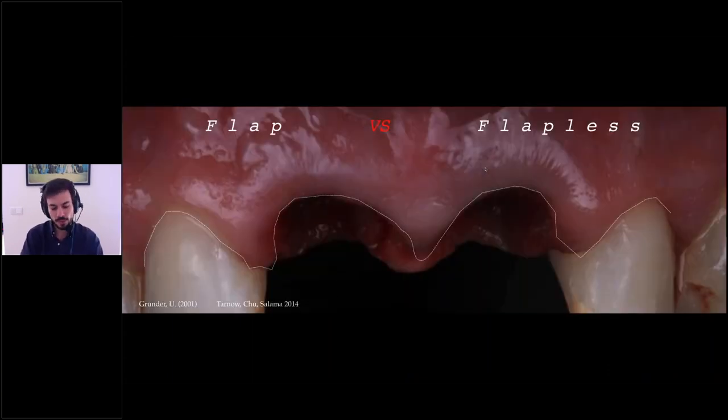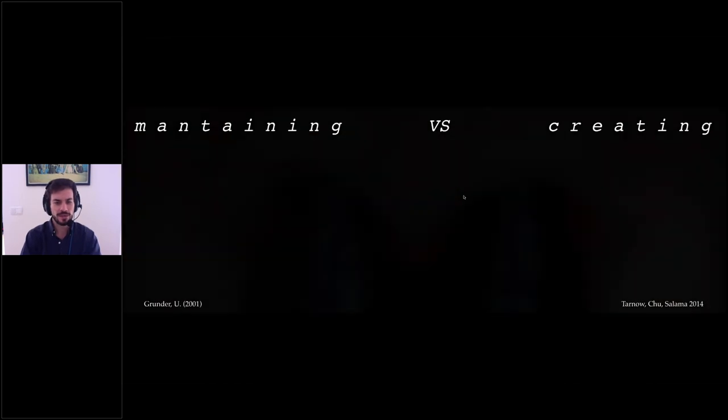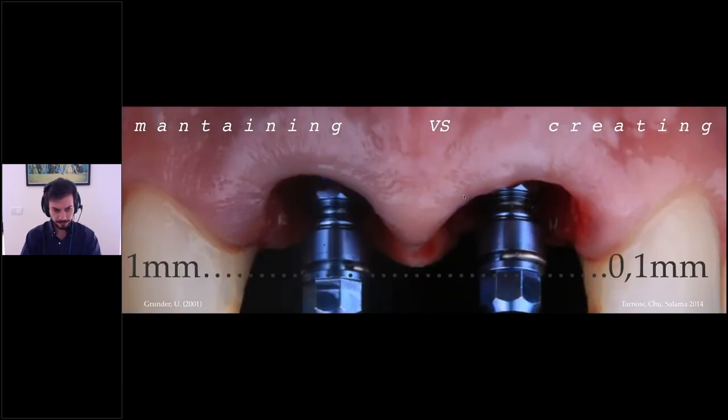So if we can go for a flapless procedure in this kind of case, we go for a flapless procedure, we go for an atraumatic extraction. You see now the atraumatic cutting off of the roots and preparing of the roots without touching our gingival margins, to be able to maintain everything. We put our implants in place, and we know that we put our implants in place in the palatal position.